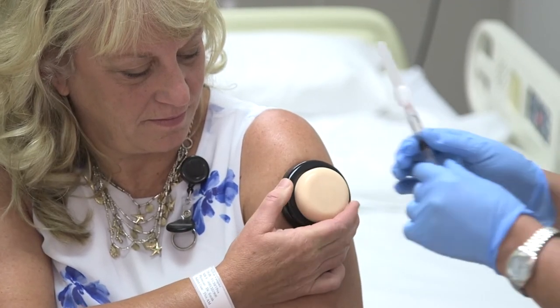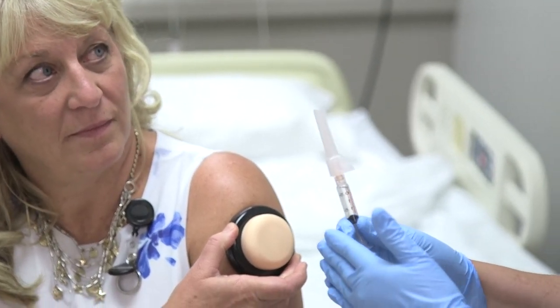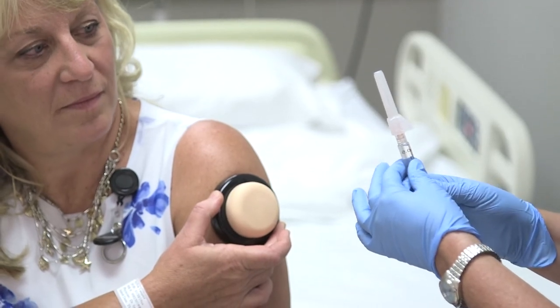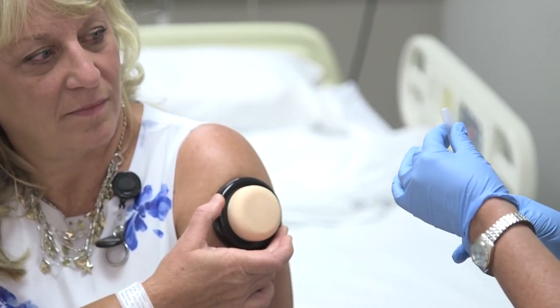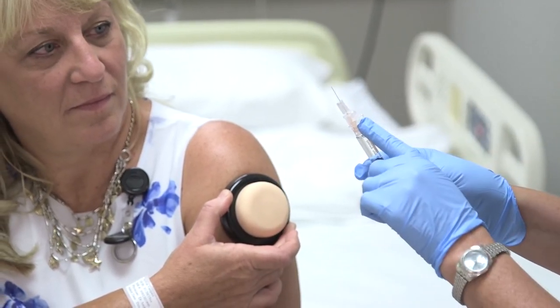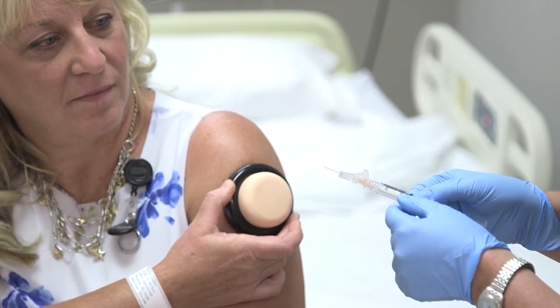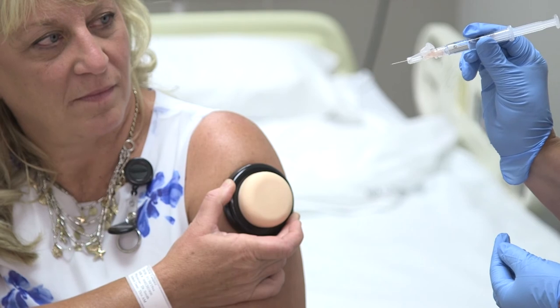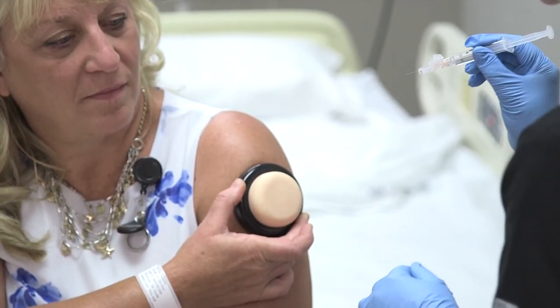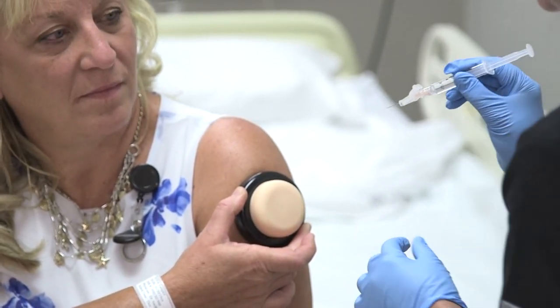And I'll just kind of pretend again that I'm doing this. Okay. So now you have your needle and you're ready to inject the medication. We would be doing Z-track, which you would have to pull the skin away from the site as you're giving it. I'm going to take the top off so you can see you have your needle and you have your safety here that we're going to engage when we're done. Make sure you note where the bevel is and you're going to hold it like a dart and then you're going to go ahead and inject as instructed. We are not going to aspirate for blood because that's not best practice.